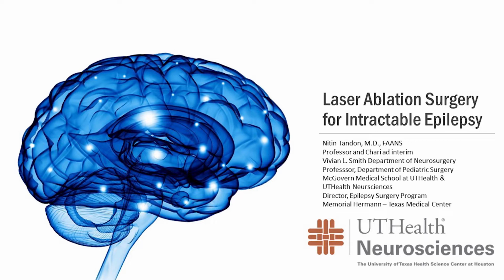I'm speaking today about a new technology that we've been using over the past several years here at the Texas Comprehensive Epilepsy Program to treat certain types of epilepsies. A technology that does not require a big open operation, but instead uses modern techniques of placing a small fiber inside the brain to then deliver laser energy and heat to destroy the seizure focus without the invasiveness of traditional brain operations.